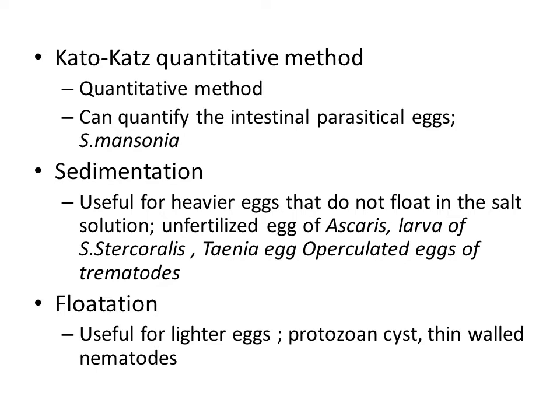The Kato-Katz quantitative method: this is the quantitative method, that means we can quantify the number of parasites present in a particular amount of the specimen, and quantify the intestinal parasitic stages. Normally we use Kato-Katz for the identification of eggs, especially for Schistosoma mansoni.